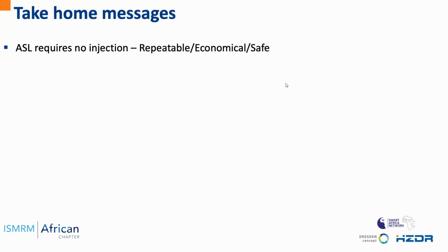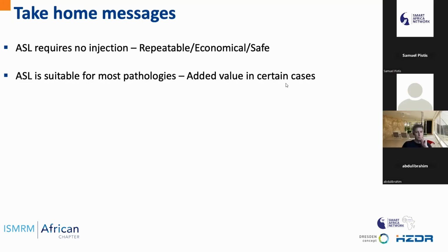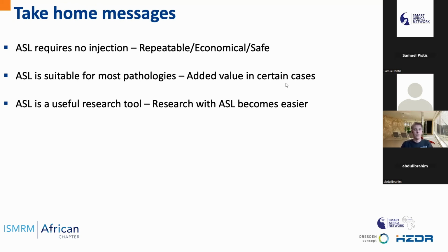With that, I would like to conclude my talk and give you 4 key take-home messages. First, ASL is a non-invasive tool that requires no injection of radiotracers nor contrast agents. It's repeatable, economical, and safe. Second, ASL is suitable for most pathologies, and in certain cases it has an added value in the clinics.